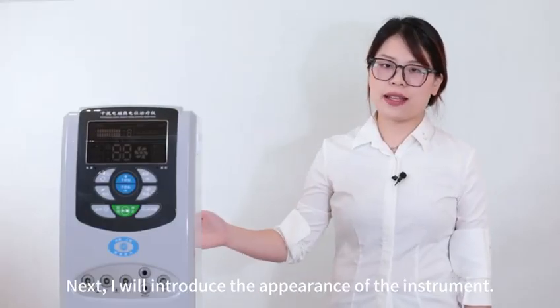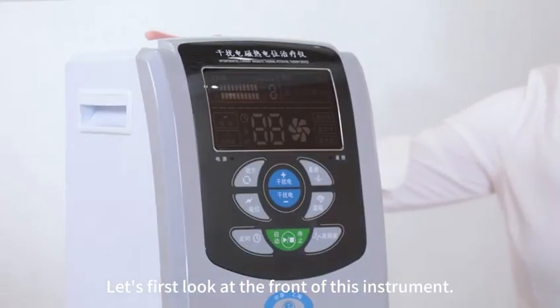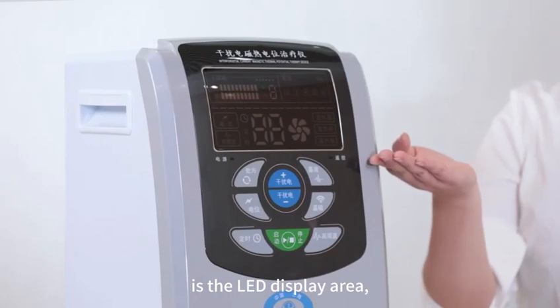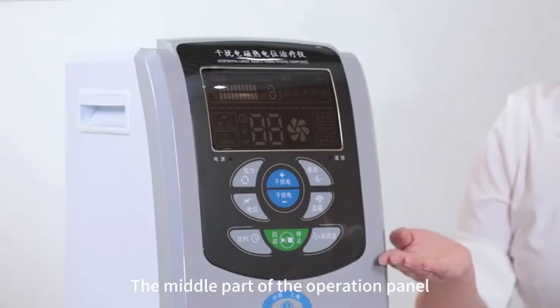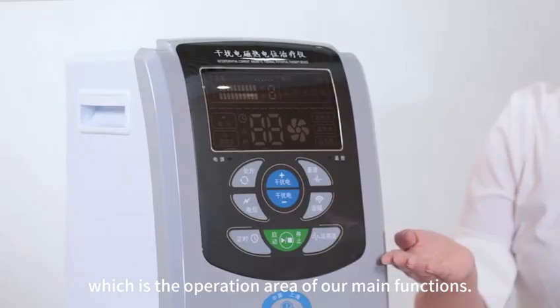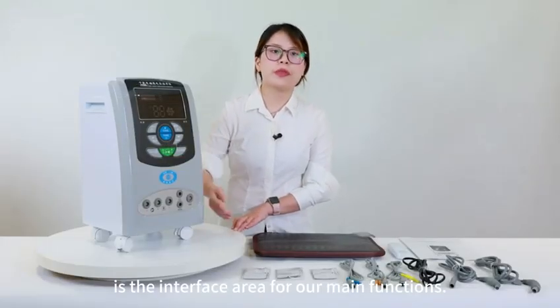Next, I will introduce the appearance of the instrument. Let's first look at the front of this instrument. We can see the top area of the instrument first is the LED display area, which is the display area of our functions. The middle part is the operation panel, which is the operation area of our main functions, and the bottom part is the interface area for our main functions.